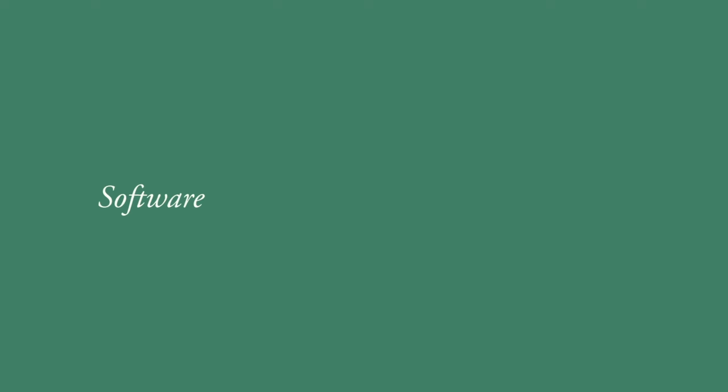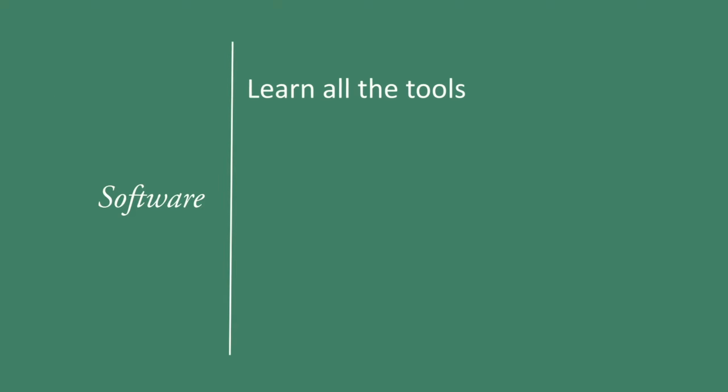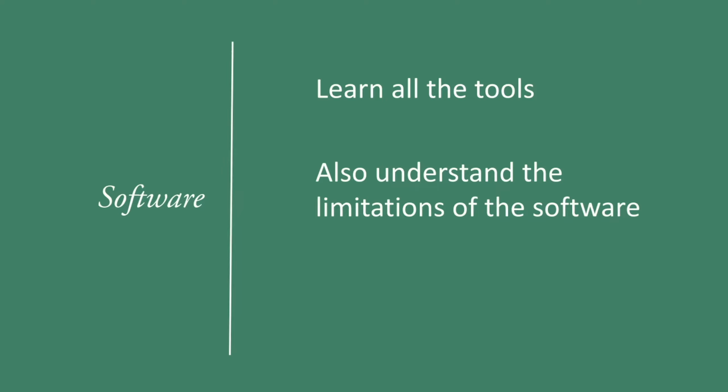It's equally important that we also know our software. Spend some time to learn all the tools available in your software. The imaging software is powerful. That does not mean that the software is free from flaws and limitations. Understanding the limitations of the software will also help us appreciate the information that we are getting or not getting from the image.